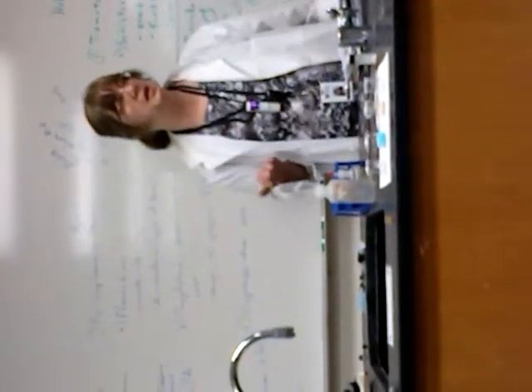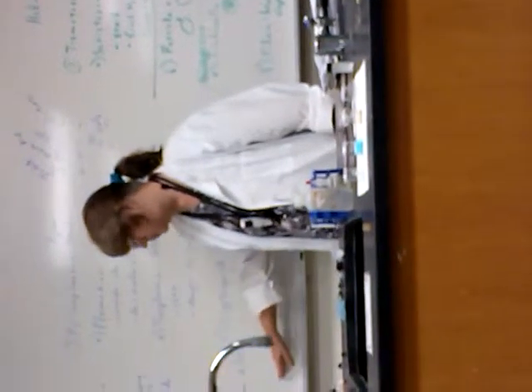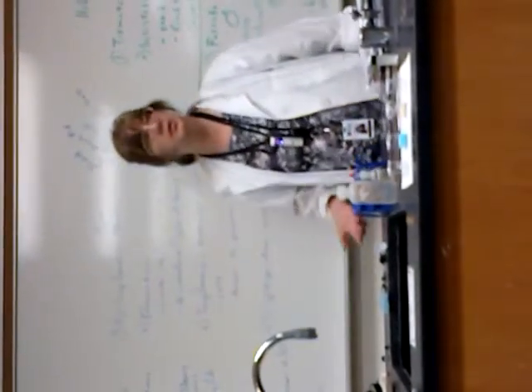Okay, Giardia at this point in time is a prevalent disease, causing diarrhea in the United States, from fresh water. Remember the old man? The two nuclei are the eyes. You have a bar for the mouth. Sometimes you can see the flagella, sometimes you can't. Diarrhea, prevalent in the U.S., in water, and in the Mexican area. And don't think that because you're in a remote area, you don't have a parasitic disease.